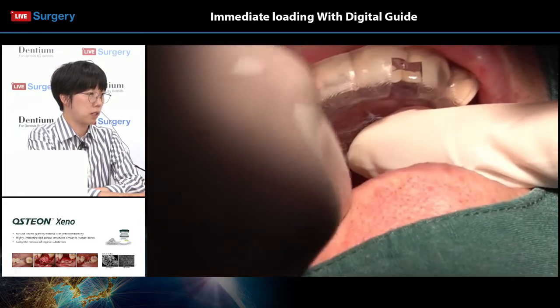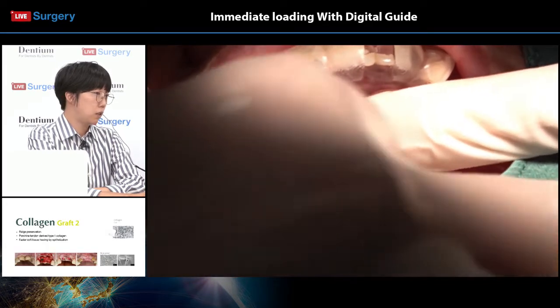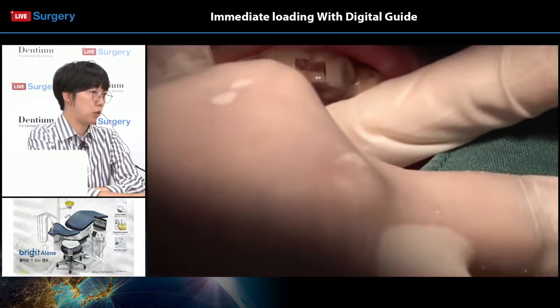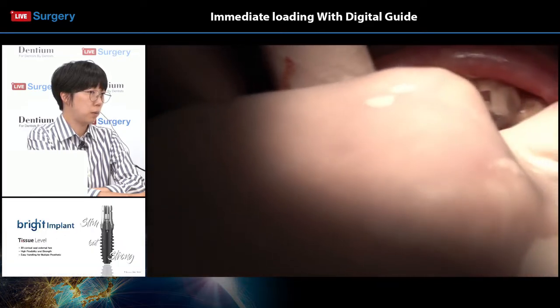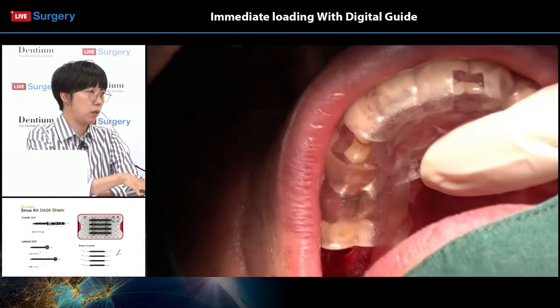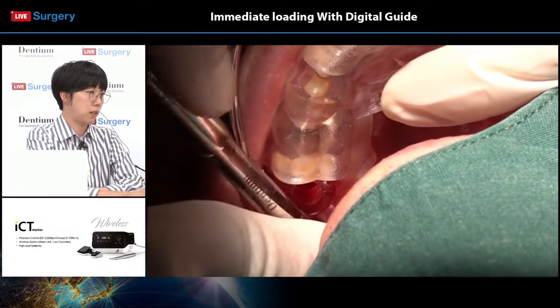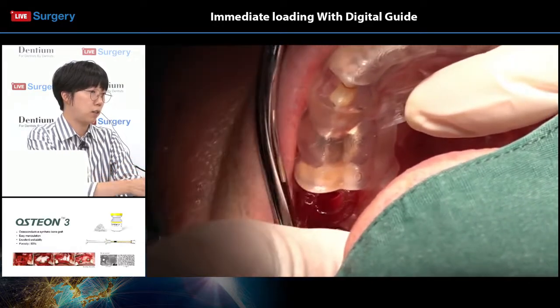Okay, so Dr. Lee has placed both implants into the areas and is now securing them with a hand wrench. By using a hand wrench, you can see that the initial stability amounts up to a certain number, Newton, but the surgeon can also feel the initial stability by the force or the resistance that he or she feels with the hand wrench.